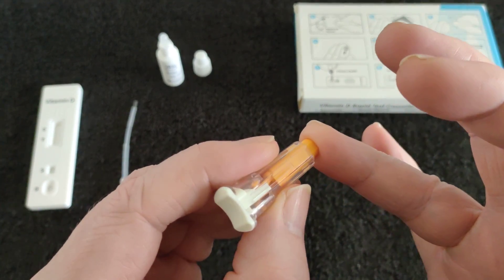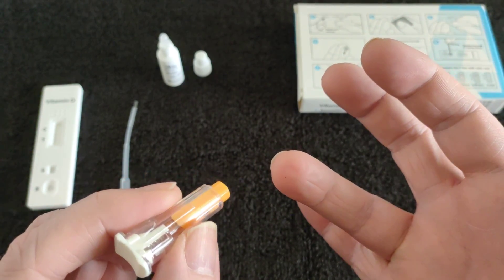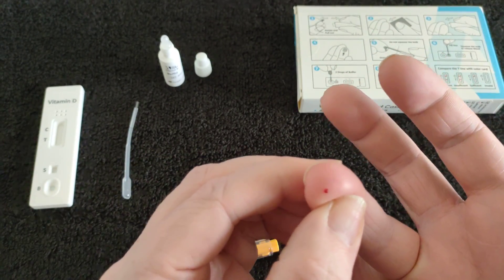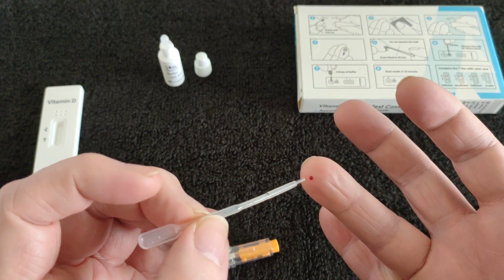I'm pretty sure this is what you do — you just press it in. I don't think that's enough. Maybe. Don't press the bulb at the top. That's for squeezing it out of the end.